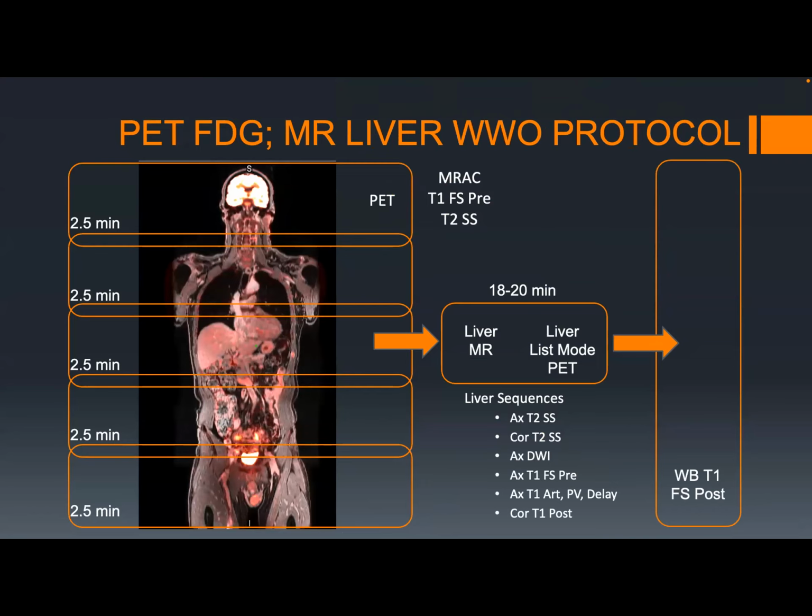All right. So here's kind of how our protocols are. Protocol design is challenging, and it takes a lot of collaboration with whoever you're working with: the MR physicists, and the respective abdominal or whatever diagnostic radiology division that's going to be looking at the MRs, because you've got to be able to fit things into the times that patients can do, and also get a diagnostic exam at the same time.